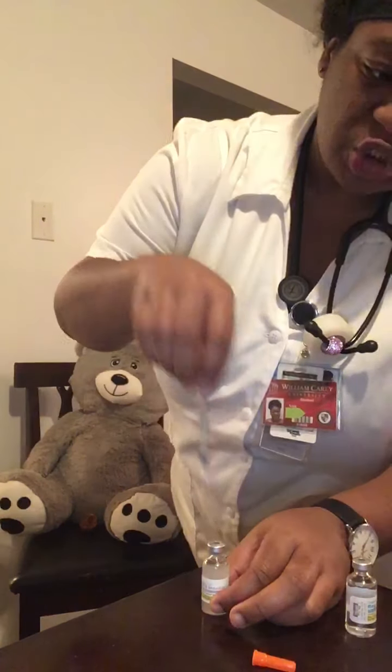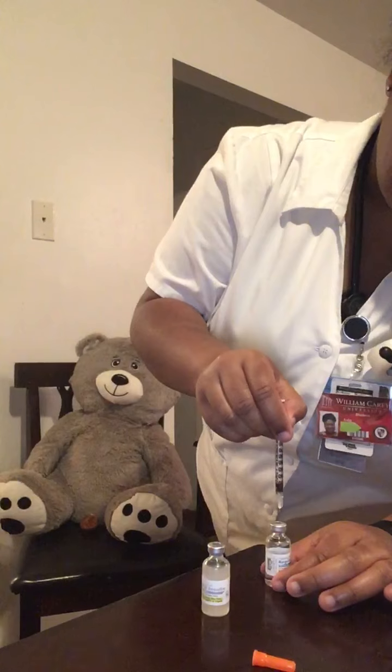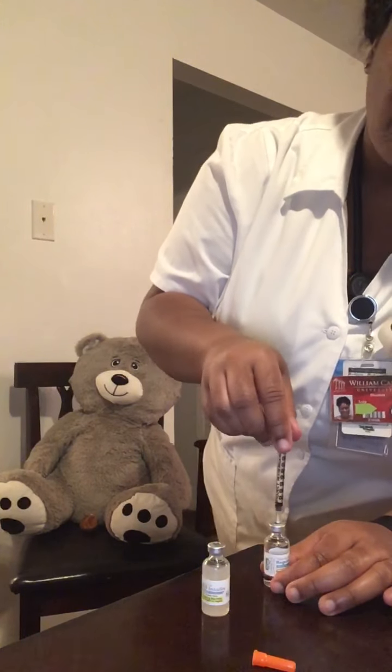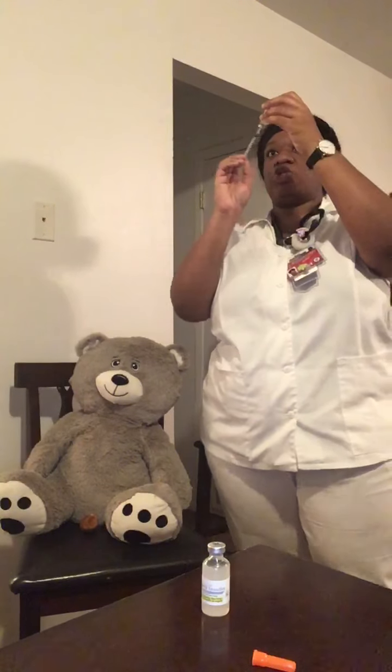Then we have 6 units of regular, so we're going to draw back 6 units of regular. Draw that into here. We're not going to pull back the needle. Now we're just going to flip it and draw 6 units, being sure not to put any air into the syringe. I have my 6 units.